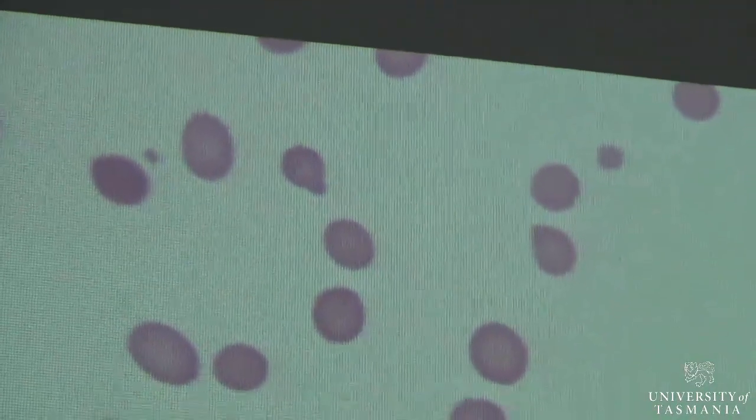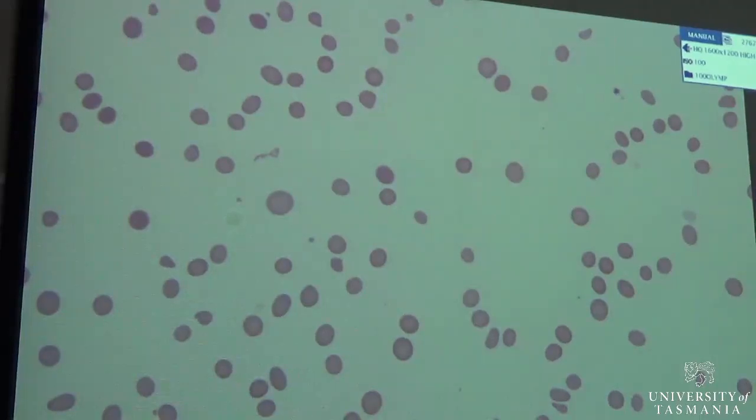So the things that you should have noticed here are particularly the fact that the cells are very large, macrocytic. Even though the MCH is 46, which is really high, the MCHC is 340, so that's normal. So the reason that you've got a high MCH is because you've got big cells. Big cells can take more haemoglobin. Okay, so it's macrocytic normochromic. It's not hyperchromic, it's normochromic because those cells are bigger but they've still got the right amount of hemoglobin in them.